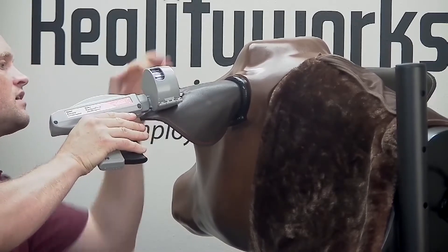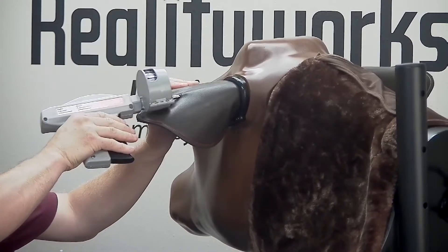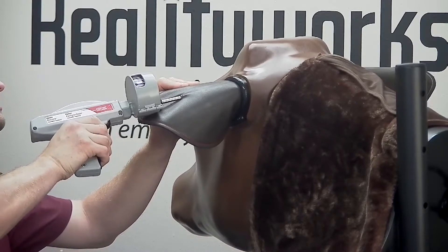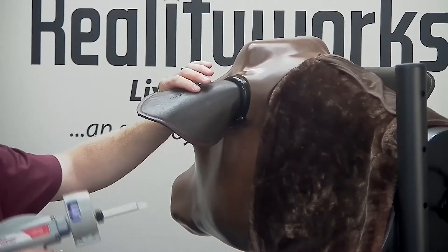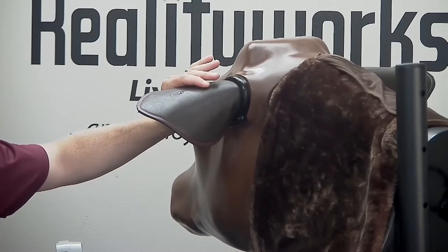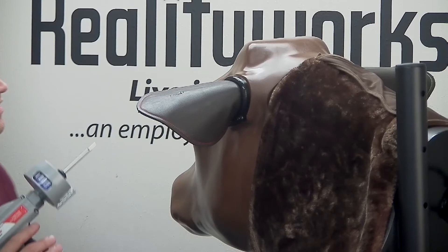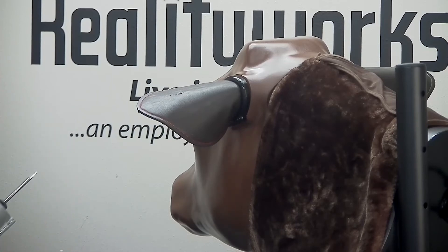Continue until the needle is almost completely inserted, then draw back — it's about an inch. Dispense the product and pull back. Inside here you can feel that pellet. You can continue to add more growth pellets on this side and on the other side.